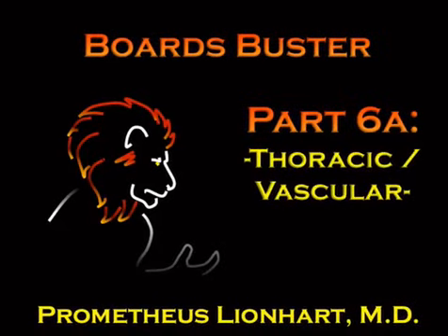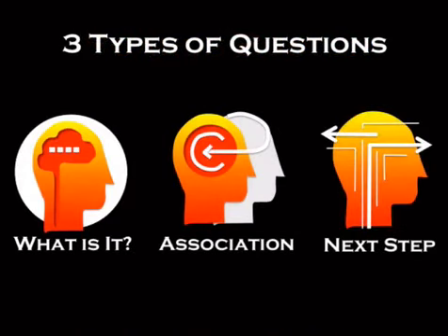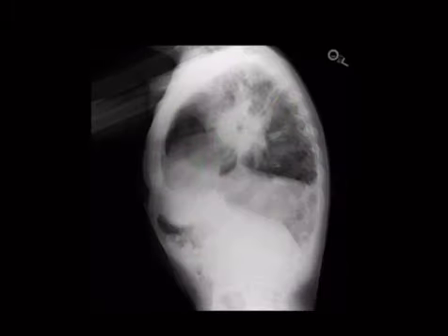Okay, guys, this is a three-part lecture series on chest and vascular. The first two lectures are chest lectures, and the third lecture is primarily a vascular lecture. Just like other modules, three basic question types. So here's our first case.